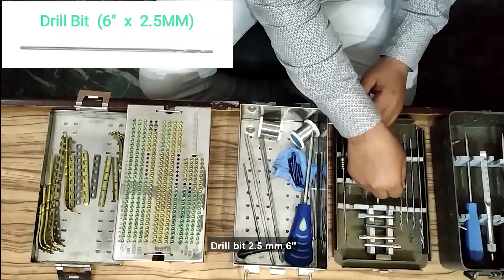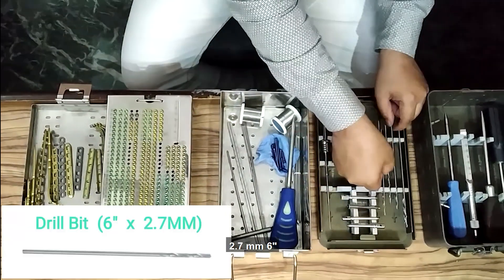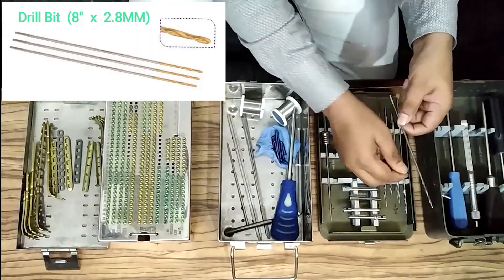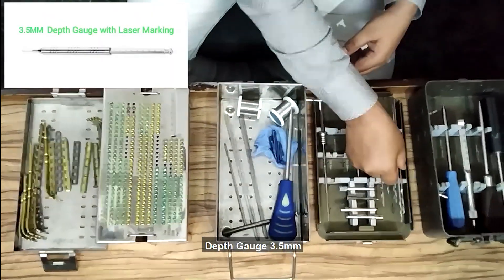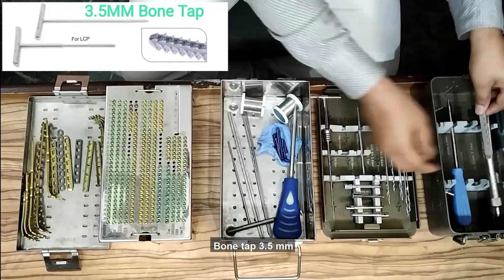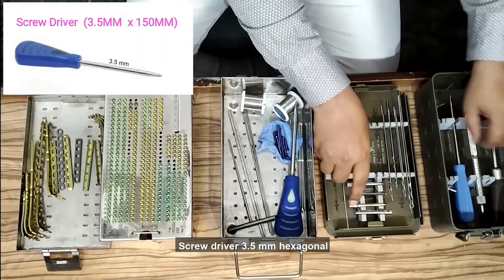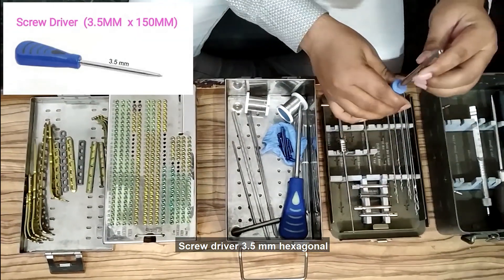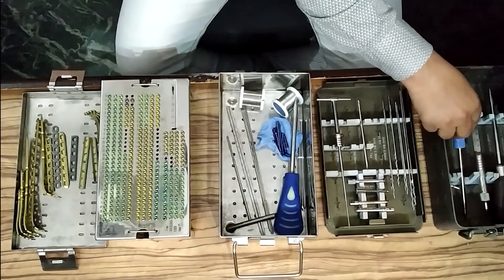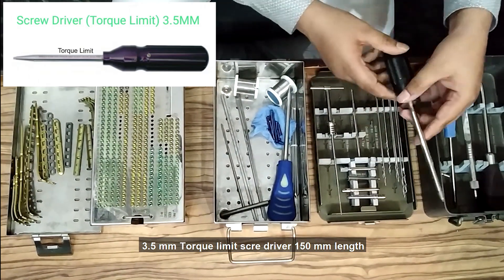Drill bit: 2.5 mm 6-inch, 2.7 mm 6-inch, 2.8 mm 8-inch. Depth gauge 3.5 mm. Bone tap 3.5 mm. Screwdriver 3.5 mm hexagonal, 150 mm length. 3.5 mm torque-limit screwdriver, 150 mm length.